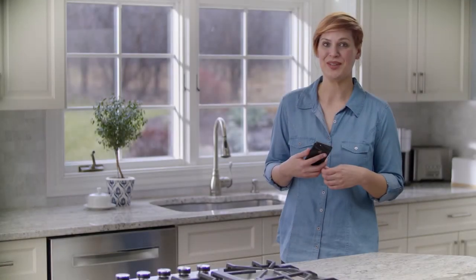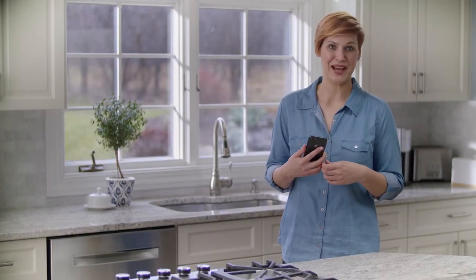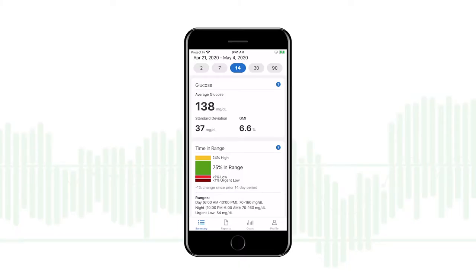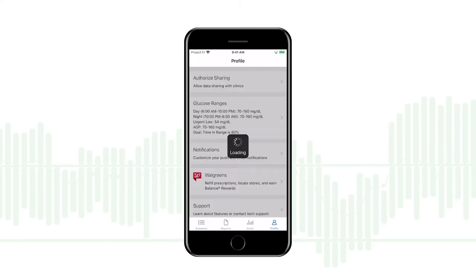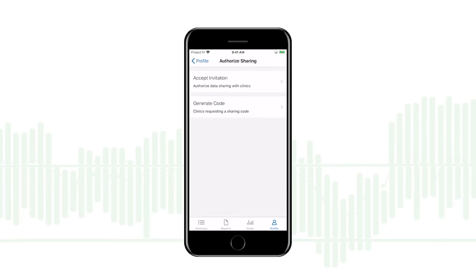In this video I'm going to show you how to use the Dexcom Clarity app. Let's show you around the app. This is where I can accept Clarity sharing invitations from my clinic during my next appointment.